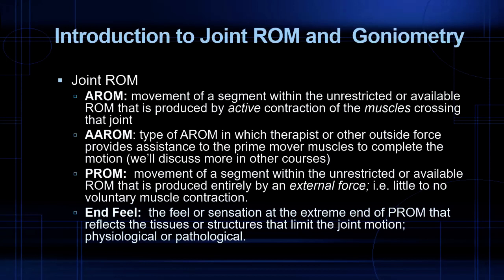Okay, and then your notes list a springy block. This one is not too common, but once in a while you'll get a springy block, like with a meniscus injury. That's where you press down, try and assess the range of motion, assess the end feel, and there's a rebound. You can either see it or feel it.